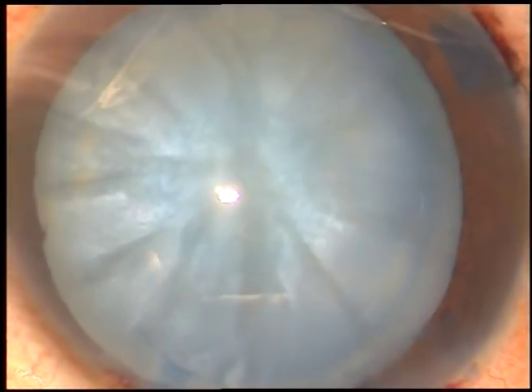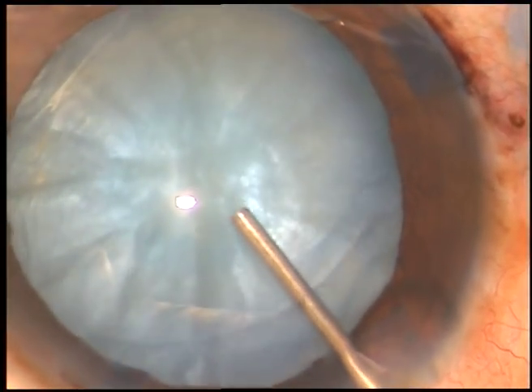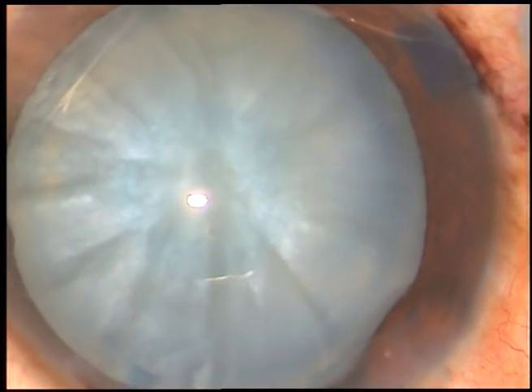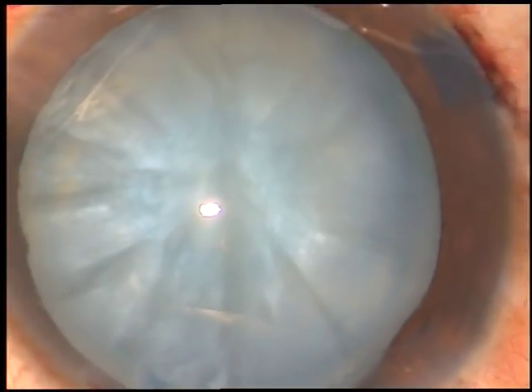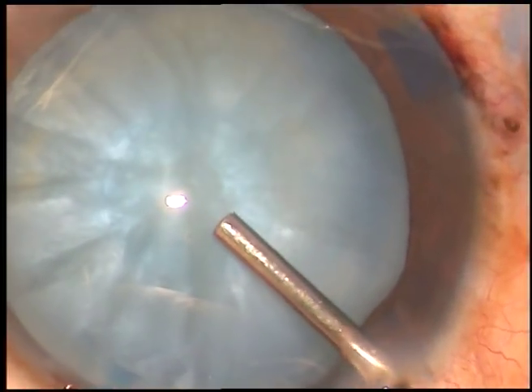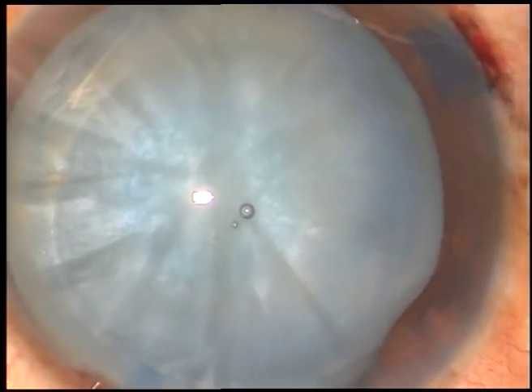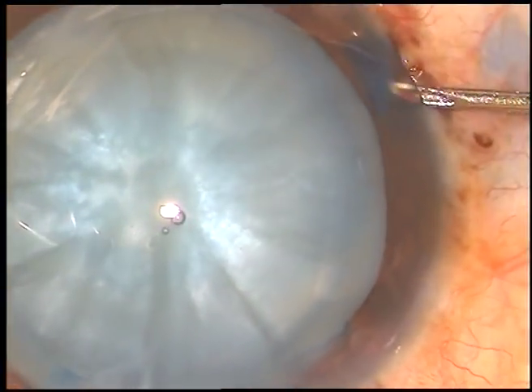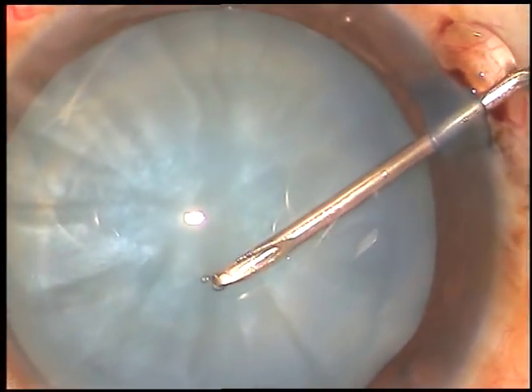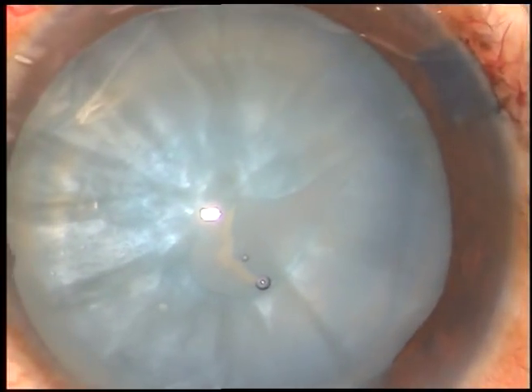This is called the modified soft shell technique. This is viscoat. And just over the anterior capsule, beneath this viscoat, this is HPMC. This HPMC pushes the chondroitin sulfate upward — viscoat upward — and this protects the corneal endothelium in a much better way.